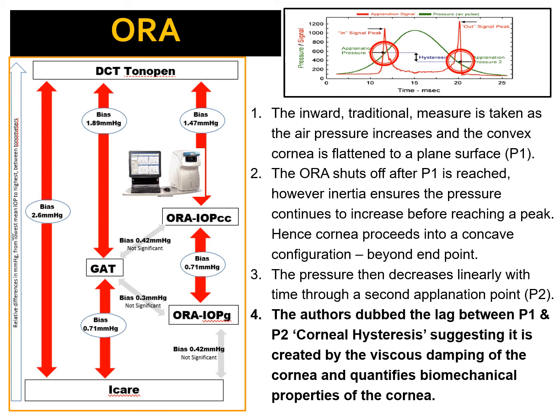So they have taken an observation of a machine and created what I would call a quasi-biomechanical concept to be associated with it. And then they're putting importance on that reading as a measure of corneal biomechanics. Something which I have to say I question.